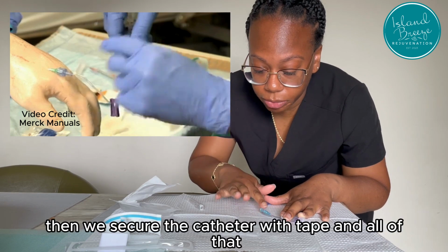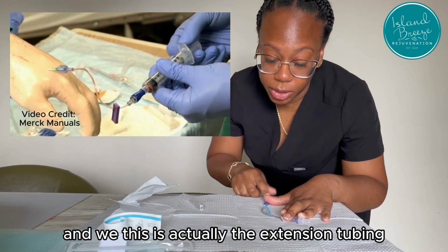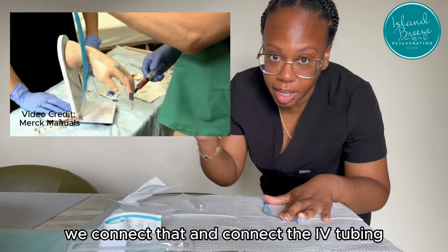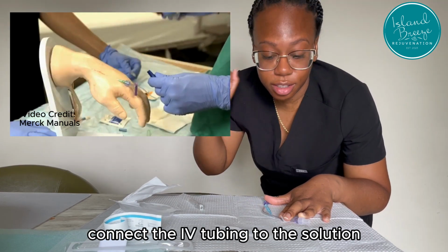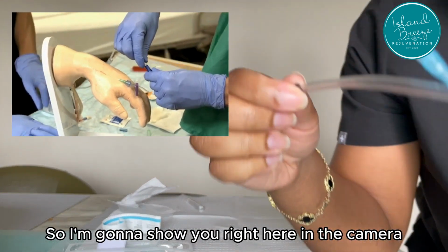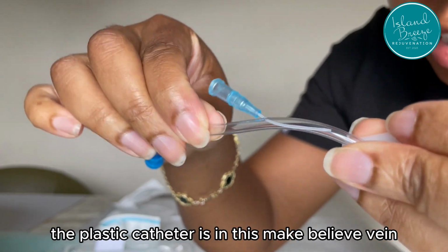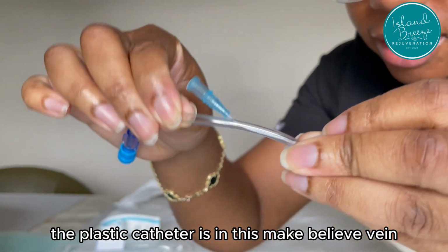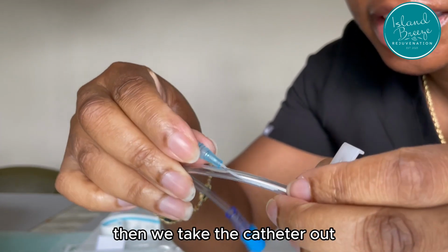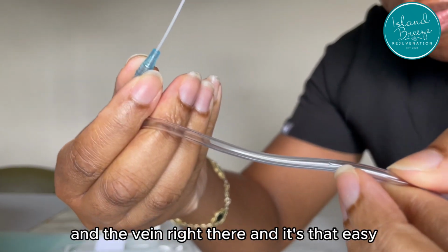So then we secure the catheter with tape and all of that, and this is actually the extension tubing that we use to hook up to the catheter here. We connect that and connect the IV tubing to the solution, and the solution goes in the client's vein. So I'm going to show you right here in the camera. As you can see, the plastic catheter is in this make-believe vein, and that stays in there. And then when the infusion's finished, we take the catheter out and cover over that hole where we entered the skin and the vein, right there.